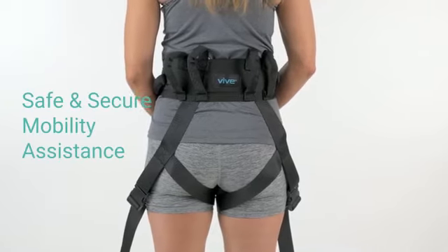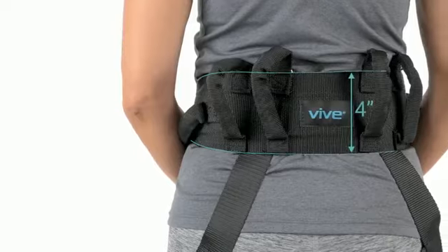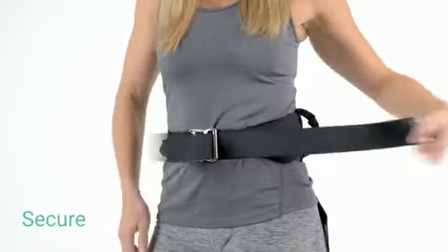The transfer belt with leg straps by Vive provides safety and security during mobility assistance. The 4-inch wide belt easily adjusts to waist up to 55 inches, while a durable metal buckle secures it in place.